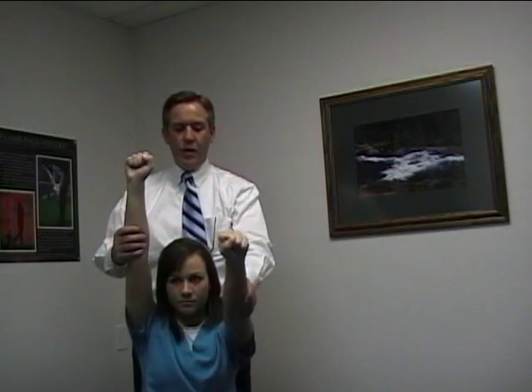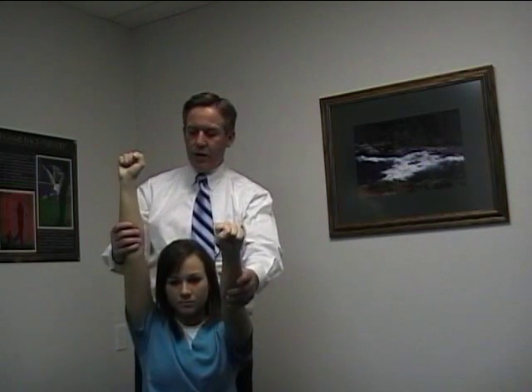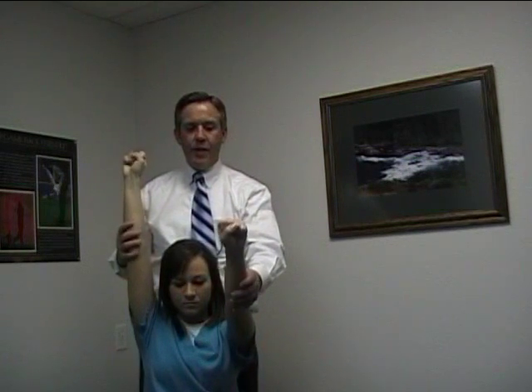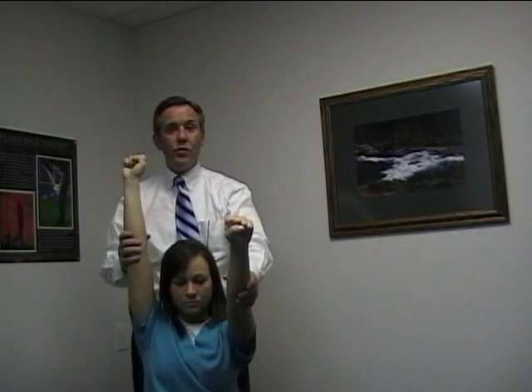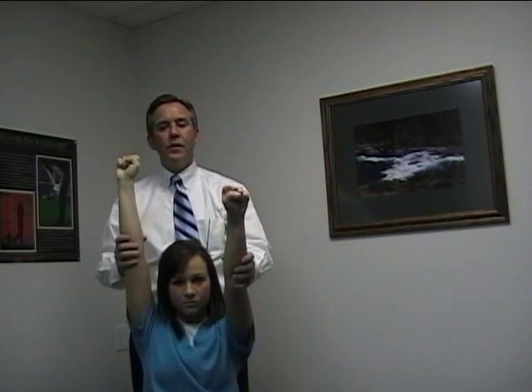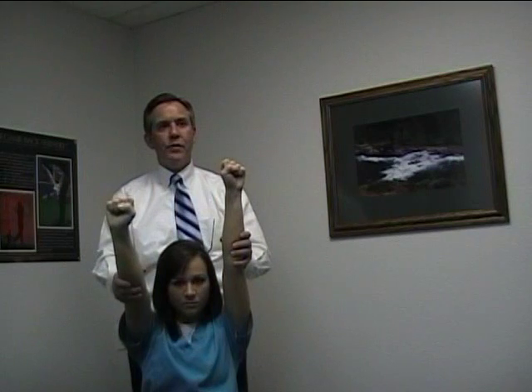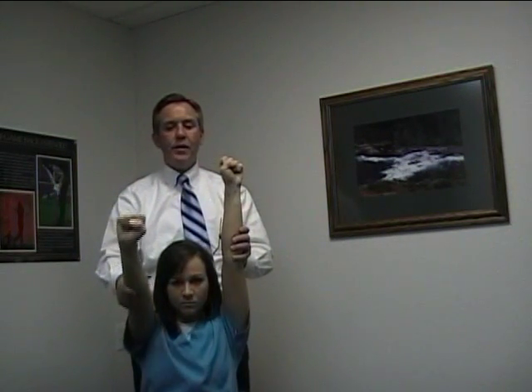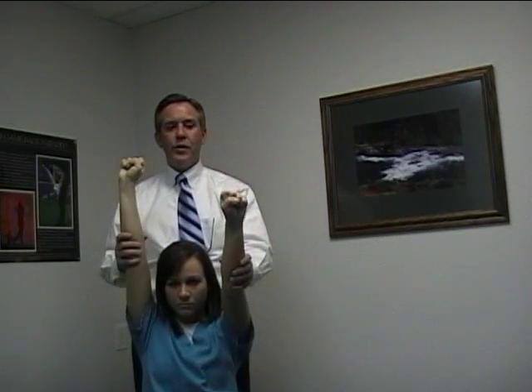Okay, if this were a patient, then what I would do is, without the shoulder pulley being up, I would have them start in their first start position, which is going to be about a 45-degree angle up and the other arm straight up. That's going to be their start position. And then what I would tell them, because you're facing the door, you're going to strengthen. So you're going to pull back and resist with the arm going down.